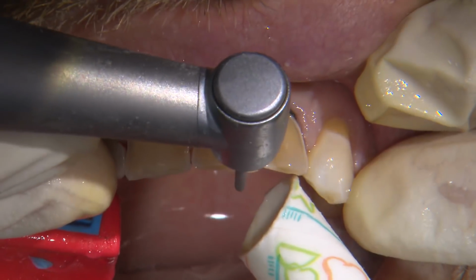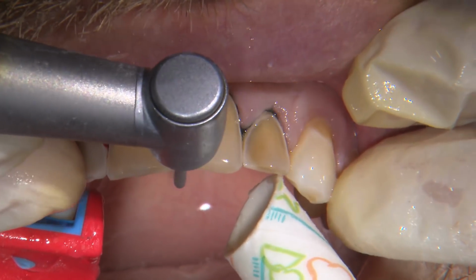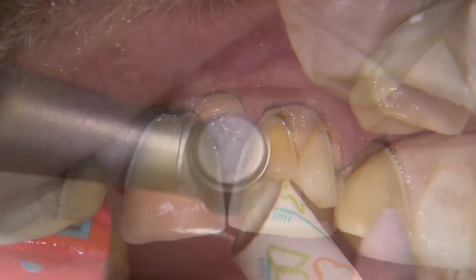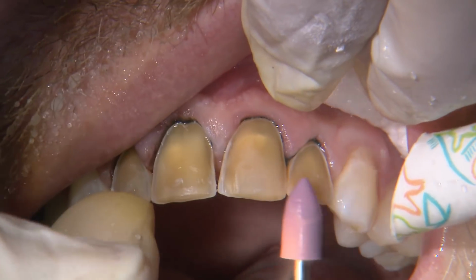We are planning to lengthen the teeth, so I flatten the incisal edges and terminate the margins at the incisal lingual junction to include the entire incisal edge within the preparations.